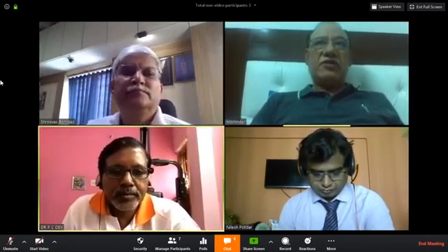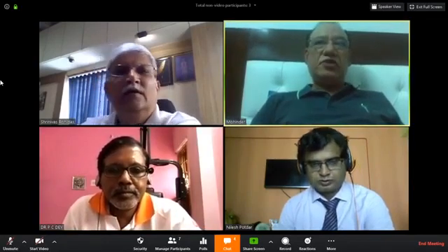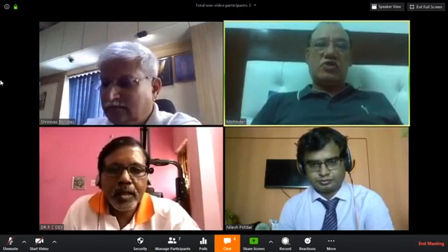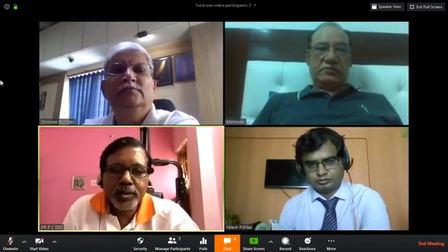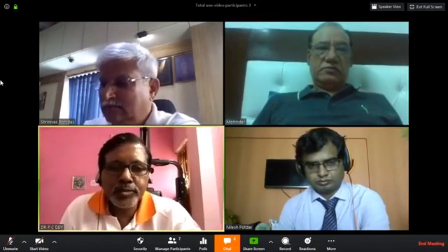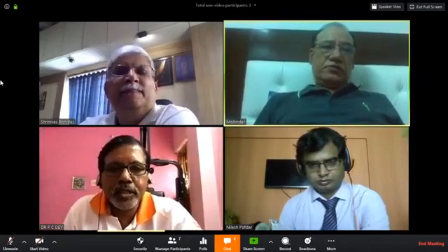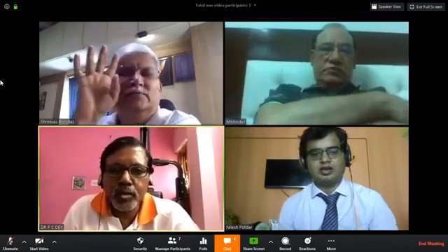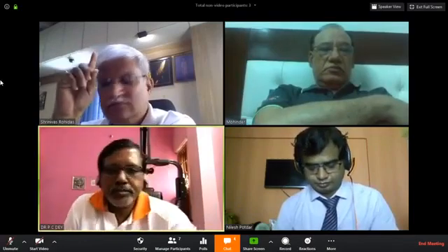Let's not confuse a shaver with a burr. Burr is different, shaver is different. The role is very, very different. Burr we use for bone work. Yes, you can use an arthroscopic burr for bone work in spine endoscopy. So the arthroscopic burr and shaver burr are the same. It is used from the shaver. The shaver machine has two sides. You can use it for the soft tissue, and you can use it for the bone. That bone side is for the burr, and that is usually what you use for the shoulder.